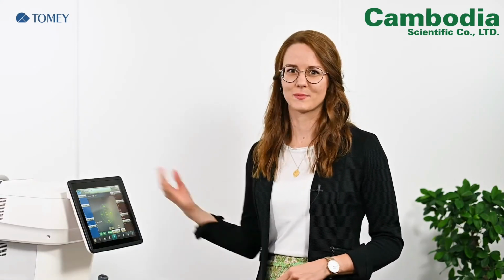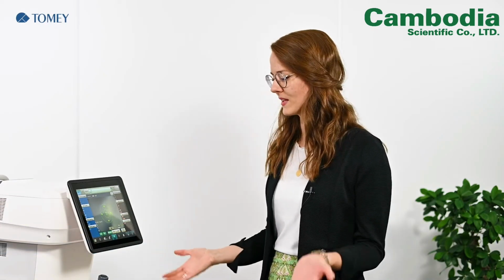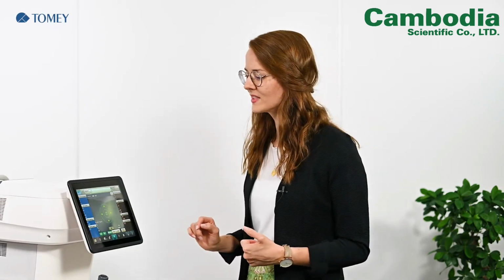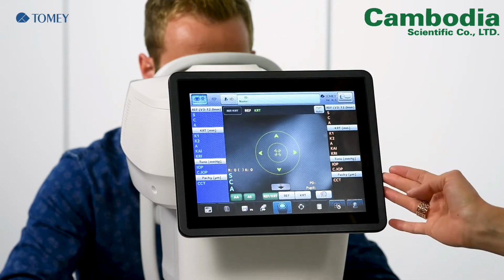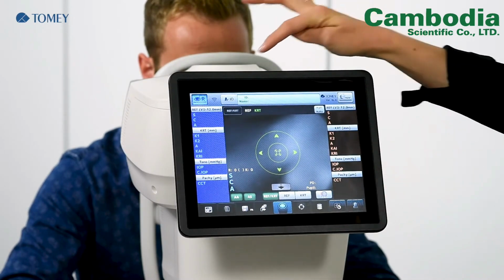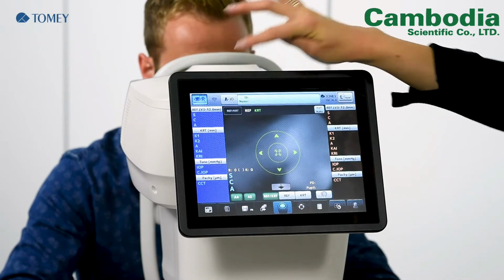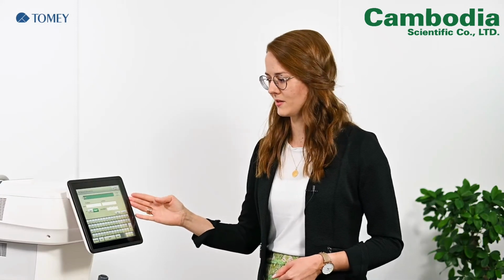This video is again about our multifunction unit MR-6000, and today we will create a completely new measurement and you will see how to perform an examination. First, after startup you will find this display and we start with creating a new patient. Therefore, you can easily go to the ID button. And here you will find the interface to enter a new patient.